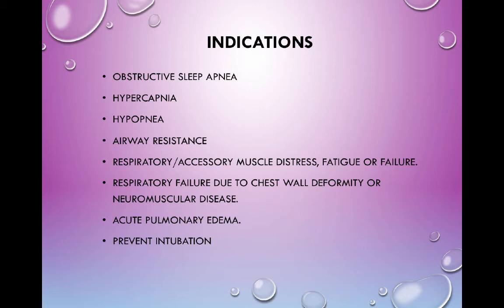There's a lot of studies now that talk about trying to get patients off of ventilators early, extubate them and stick them on BiPAP. I don't know that I totally agree with that, but there's studies out there. The whole idea of ventilating them until what got them there is resolved, we're sort of trying to push it a little bit. And if we have to re-intubate them, we're kind of backing things up another couple of days. So it's still kind of up in the air whether that's a good thing or a bad thing.